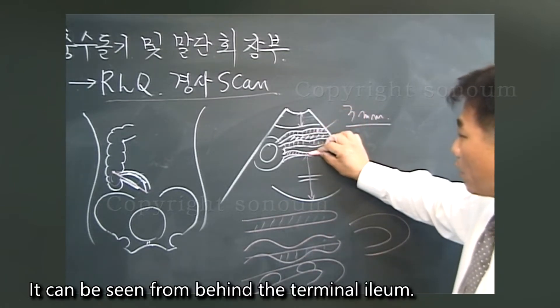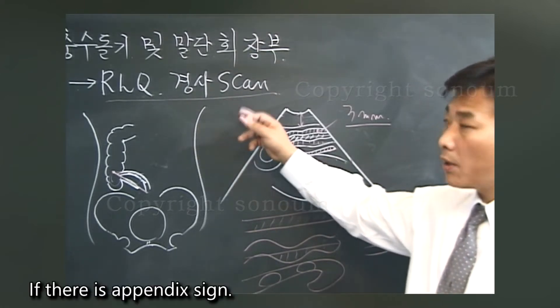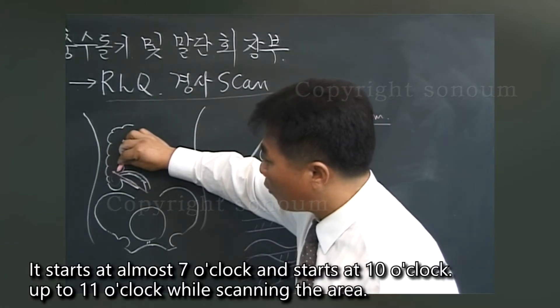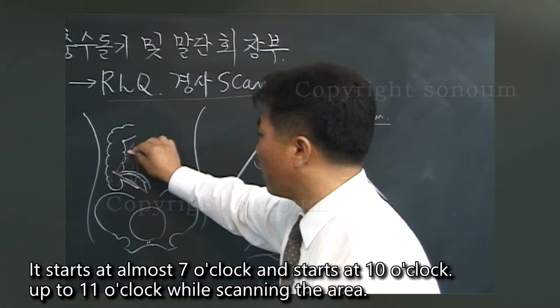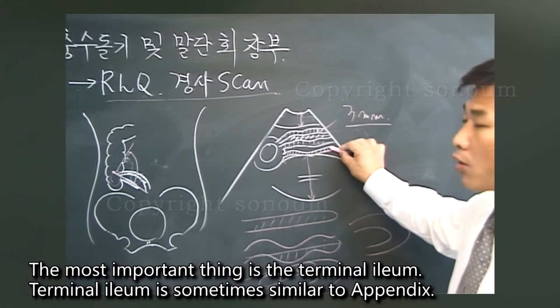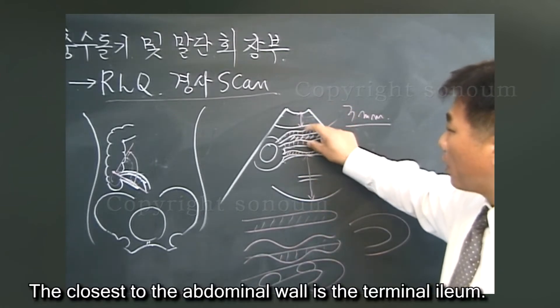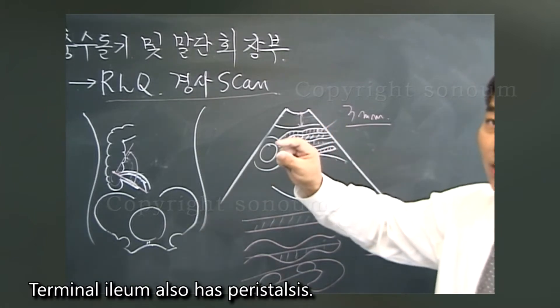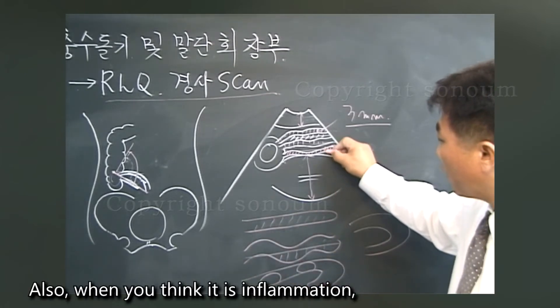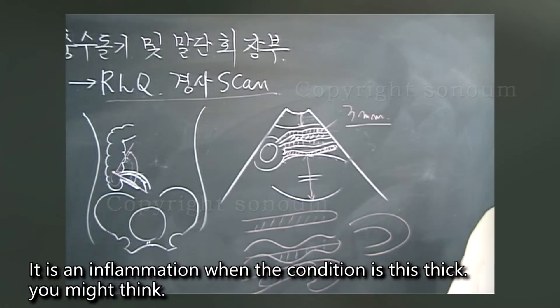The appendix can be seen from behind the terminal ileum, but it is difficult to observe under normal conditions. Orient the probe scanning from almost 7 o'clock up to 10 or 11 o'clock. The terminal ileum is the most important landmark — it is closest to the abdominal wall and shows peristalsis, whereas the appendix is blocked at one end. When inflammation is suspected, the AP diameter is usually six millimeters or more.